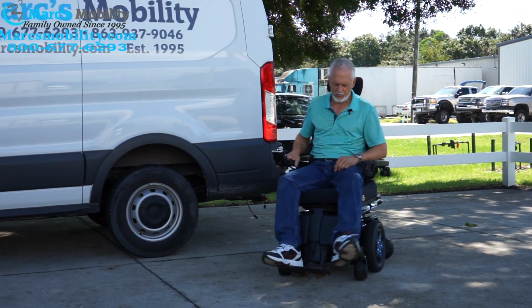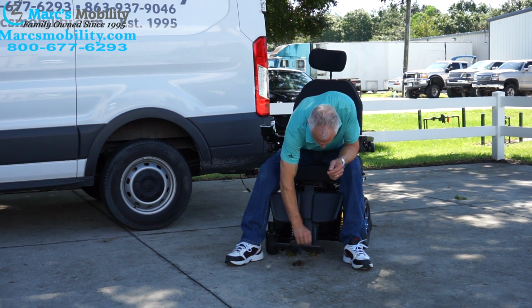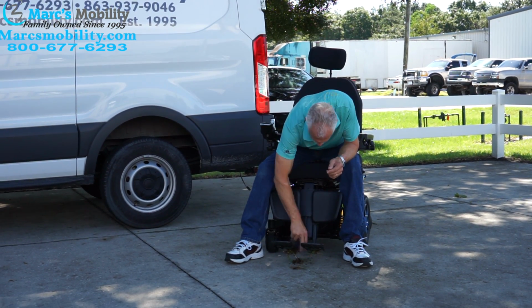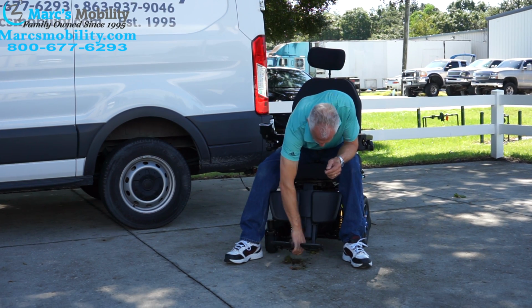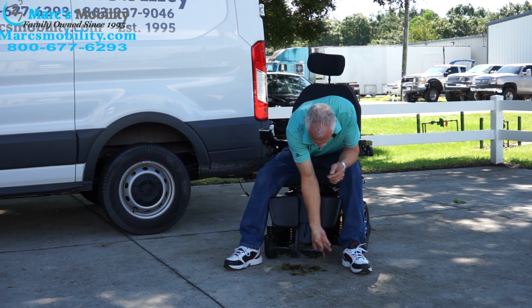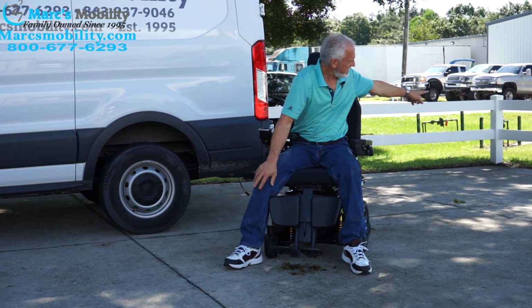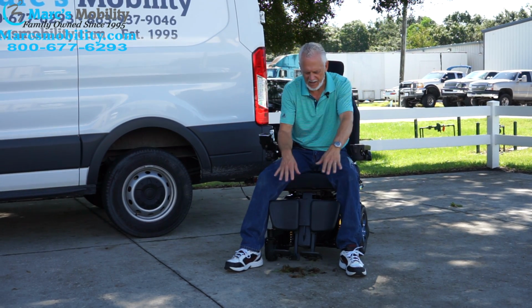All right, I got a little bit of grass in the chair. That's my fault. All right, now that's pretty neat. Never done that before. All right, so right there's a hump, and I went into it. The legs were too low.